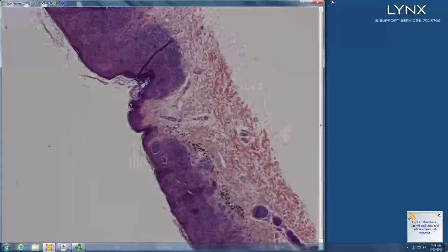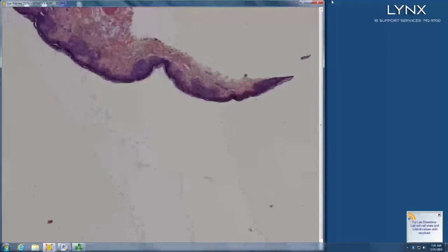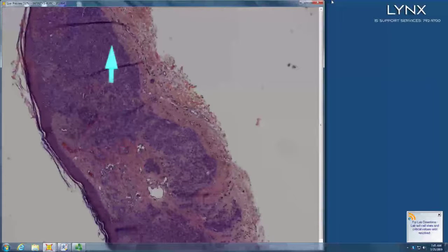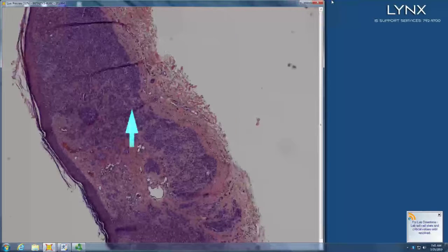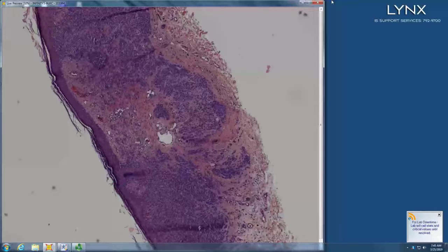I only got a melanocytic proliferation. It looks kind of bad. Melanocytic, kind of bad. Yep. So is it symmetrical? Not really. Do these mature or disperse? No. Do they push and bulldoze the connective tissue beyond them? Yep. And confluence at the junction, effacement of the rete, that's vertical growth phase melanoma.